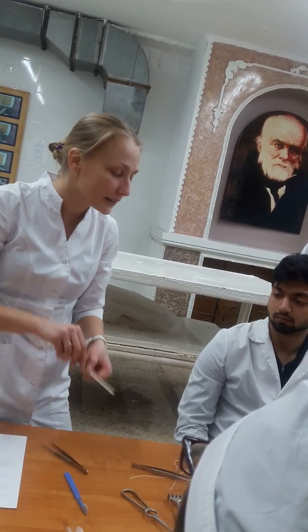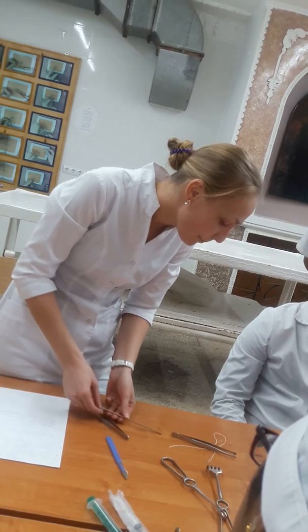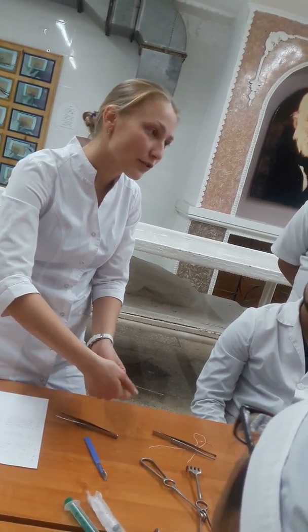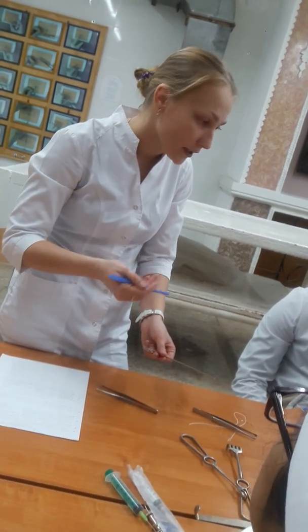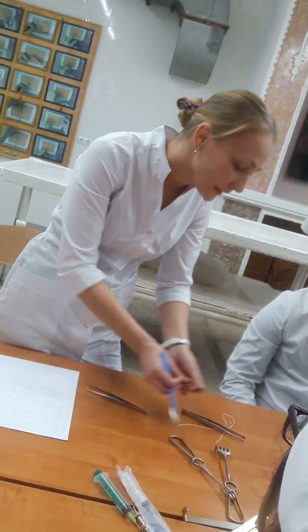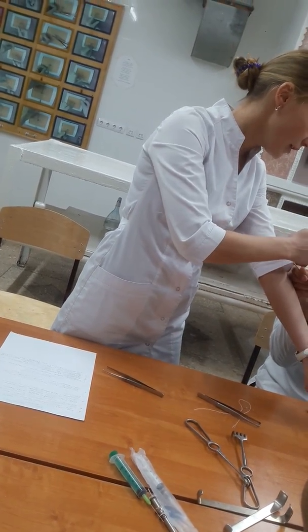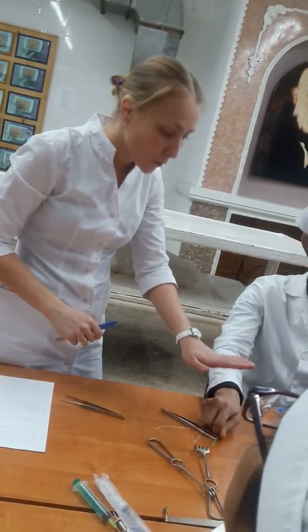After that, in this small puncture incision, she puts a probe, because under the fascia a neurovascular bundle could be located. This instrument protects it from my sharp instrument. It could be scissors, it could be a knife, it could be a scalpel. I put it under the fascia, help me, and make an incision. Use this instrument this way. So, this is the probe.